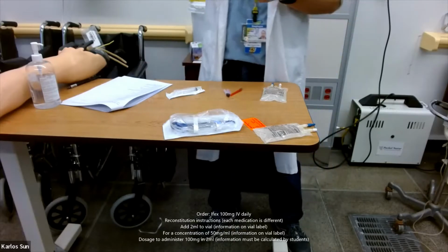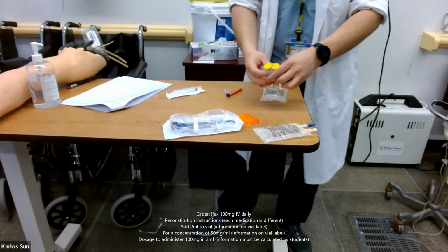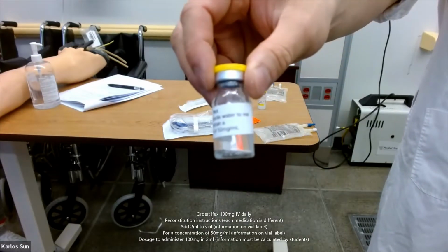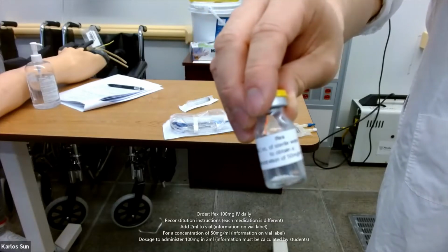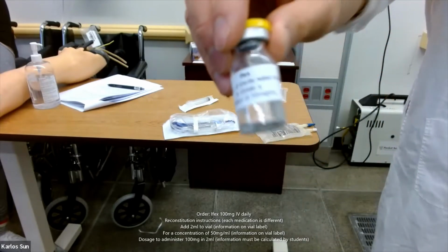In this example, our order is IFEX 100 mg IV daily. In the reconstitution instruction, we have to add 2 milliliters to the vial for a concentration of 50 milligrams per milliliter. So the dose we're going to administer is 100 milligrams, so that would be 2 milliliters after reconstitution.